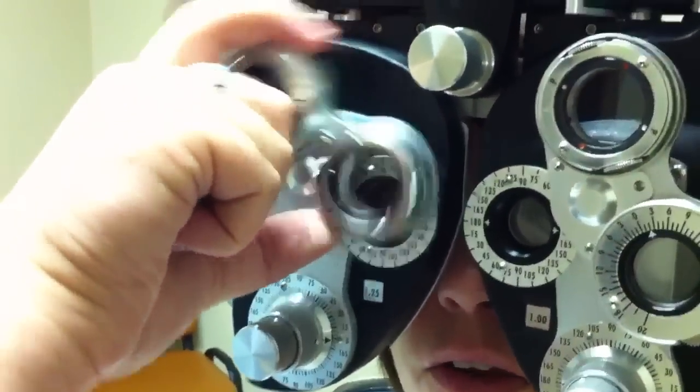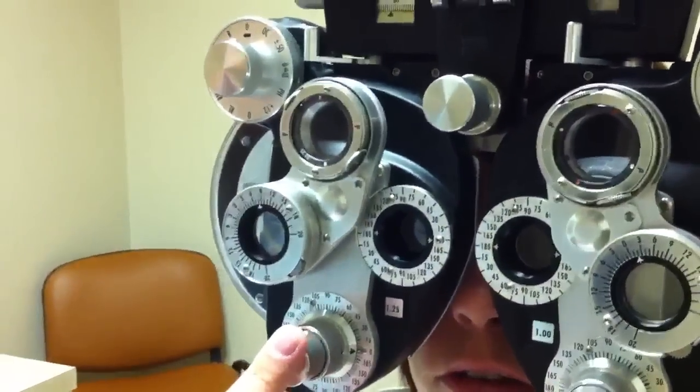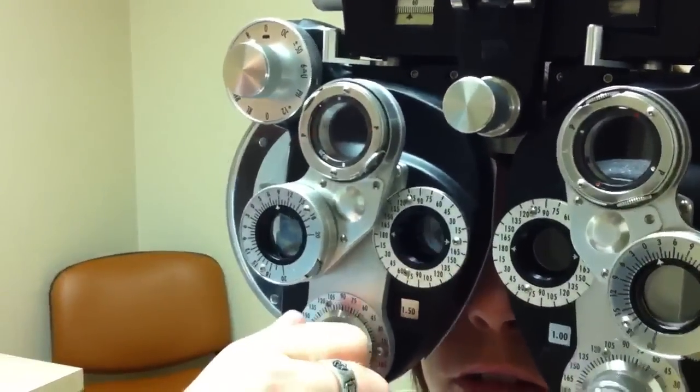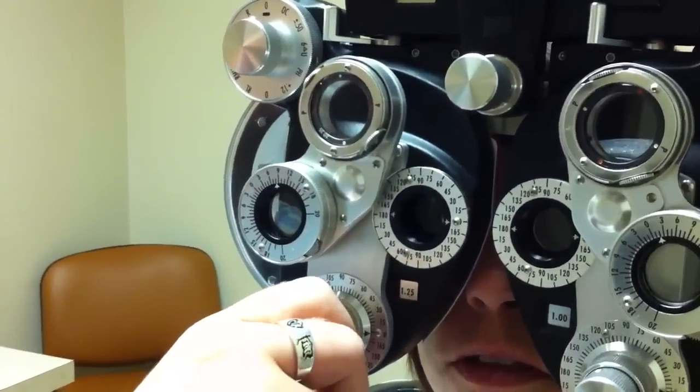Usually at this point, if it's between two like that, I may ask which is better — one or two? They're the same, about the same. So I'll keep it on her old power.